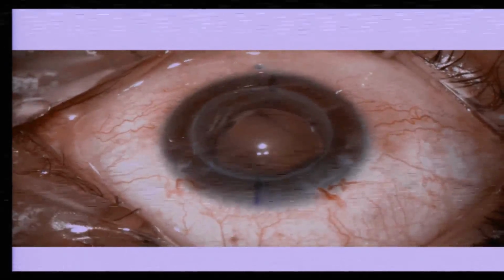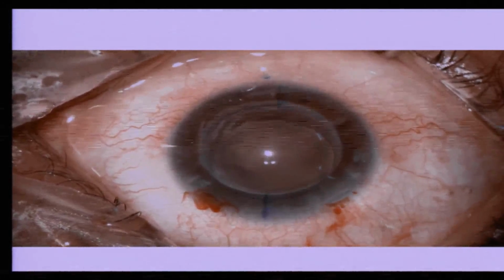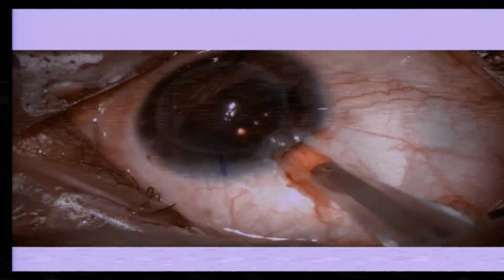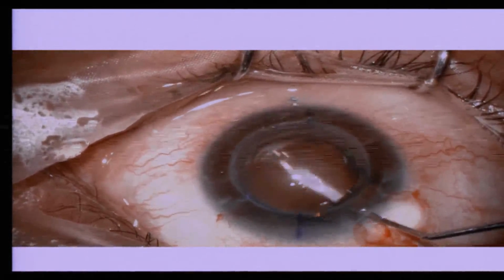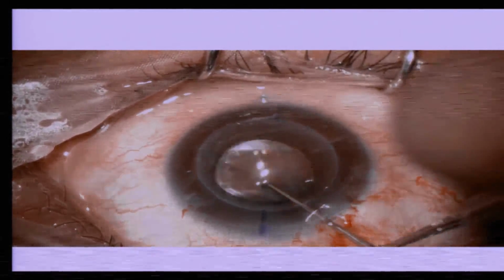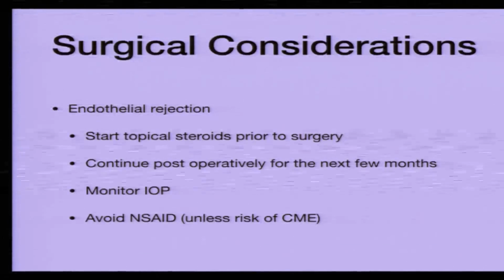It's important that you suture your wound at the end of surgery, because of the nature of these wounds, you sometimes cannot pressurize the eye, and because the graft-host junction is very close to your wound, hydration of the wound is also not advisable, because you can sometimes end up creating a DM detachment. So I think best is to place sutures and ensure that your wound is watertight. In this case, we were able to put the lens, and the patient had a very good visual outcome.